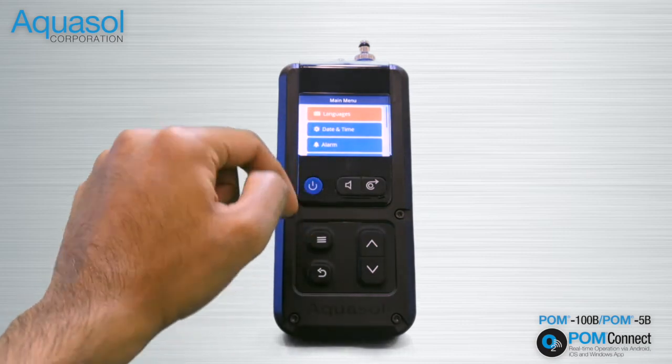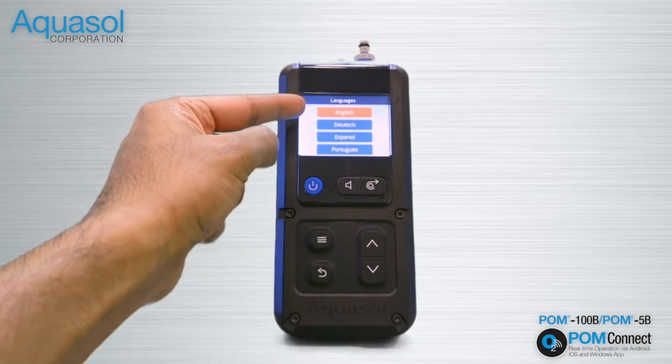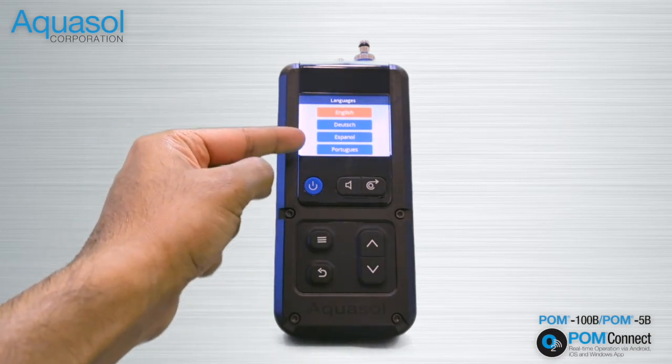Select Languages and press the menu enter button again. The Aquasol POM 100B comes with four preset languages: English, German, Spanish, and Portuguese.